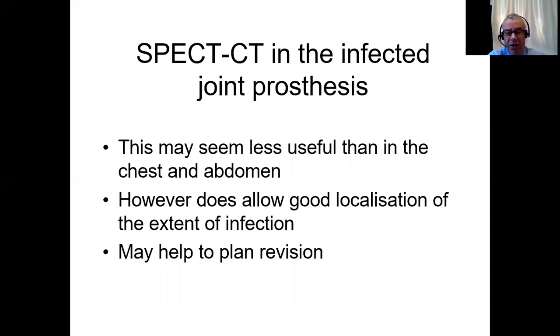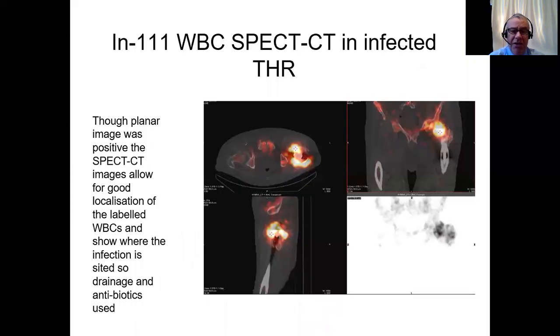Maybe less useful because we can still use things like bone scanning as well, but it may be useful in particular situations, particularly things like chronic inflammation. The other thing is that quite often doctors, or the surgeons, know whether they've got an infection, they just don't know where it is.